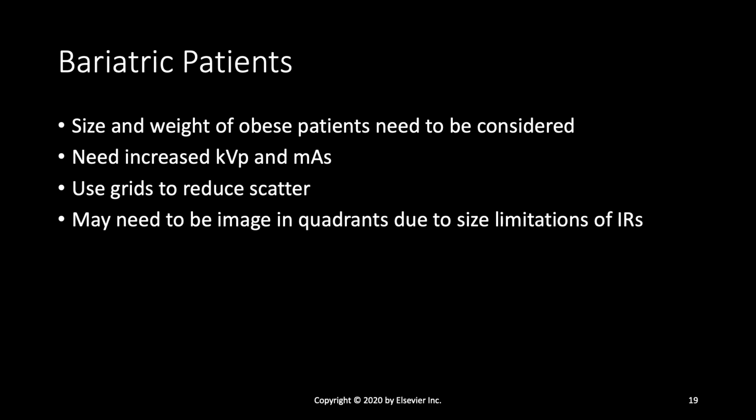Imaging patients who are categorized as obese are becoming more common in radiology. Now that we have bariatric surgery, this is becoming more routine, and therefore imaging procedures may be needed both before and after the bariatric surgery. Bariatric patients bring unique challenges in terms of their weight and body diameter.